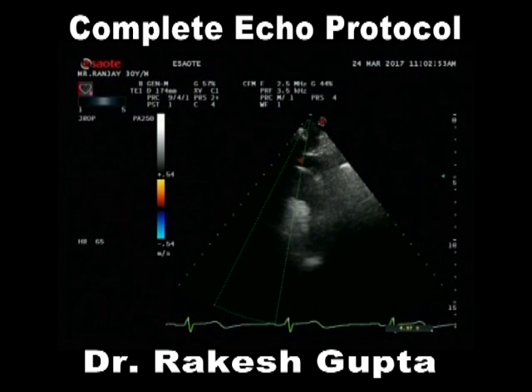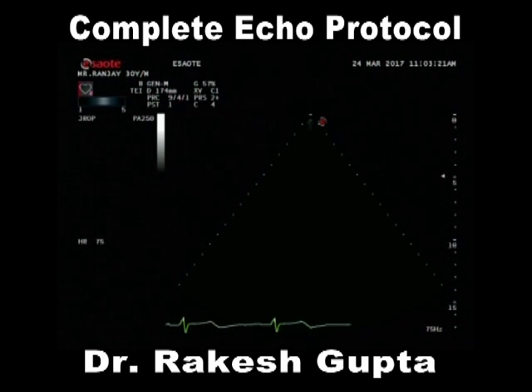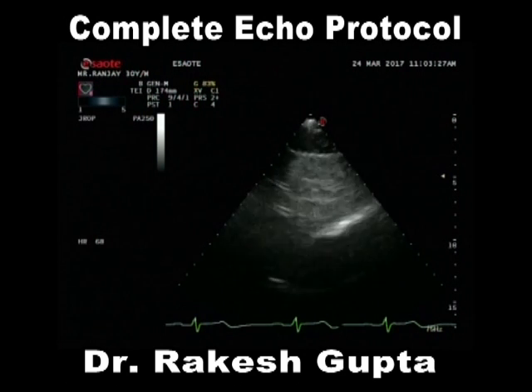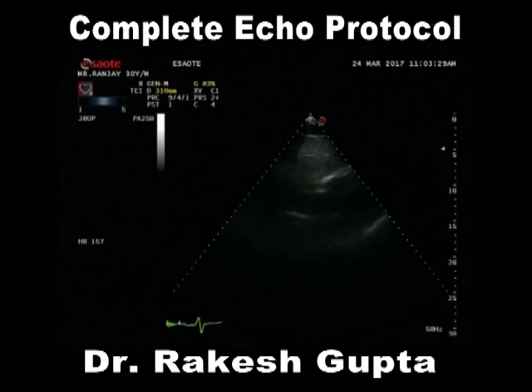And once we have done this ascending aorta, descending aorta, arch of aorta, here we can look at descending dissection of aorta as well as other features. For the aortic valve, which all windows should we utilize? We should use 5-chamber, we should use 3-chamber, we should use the right parasternal window, then we use the arch of aorta, then the right anterior view and a subcostal window which we can utilize for assessment of aortic valve gradient. And you need not take the average, you have to take the maximum gradient during this time.